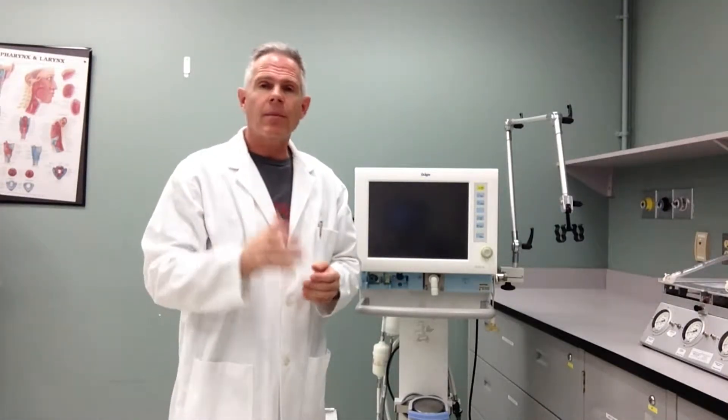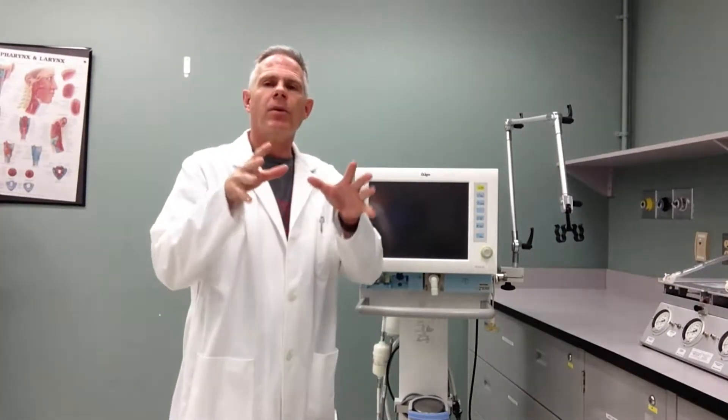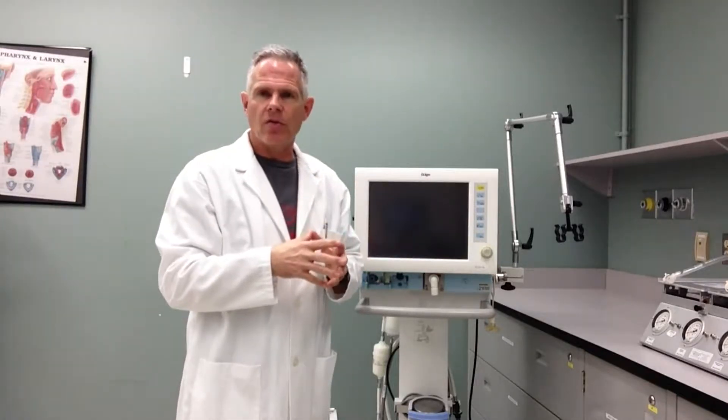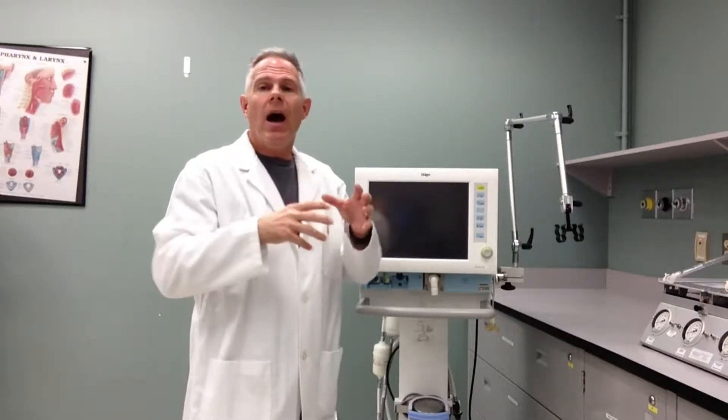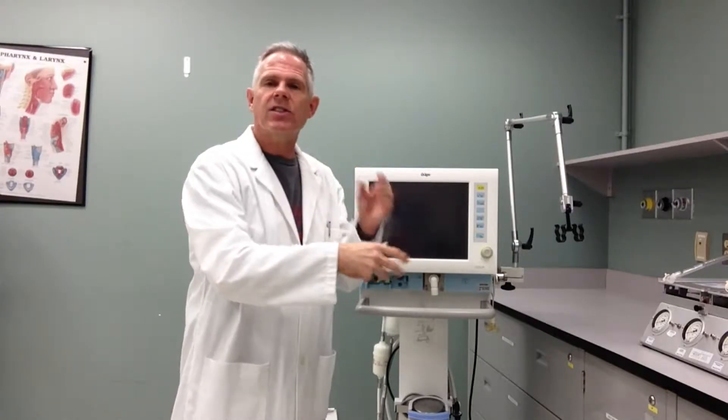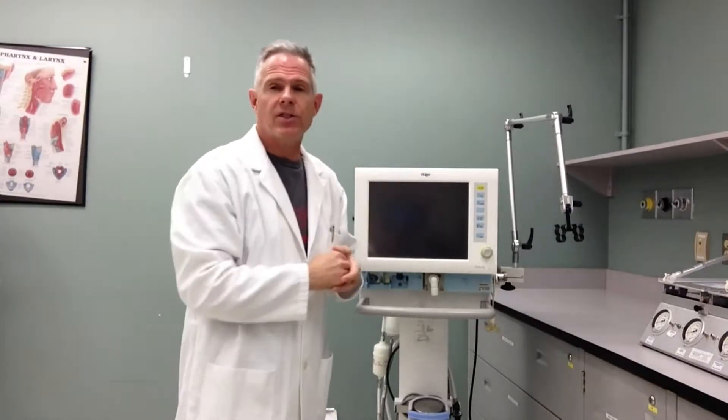Hi, my name is Alan Prost and I'm going to demonstrate for you today how to put a circuit, a clean circuit on a ventilator and get ready for patient use. I'm not going to do the ventilator checkout for you, I'm just going to demonstrate a process by which you can maintain cleanliness and keep a clean circuit before you attach it to the patient.